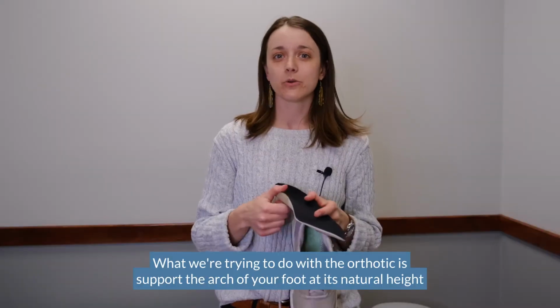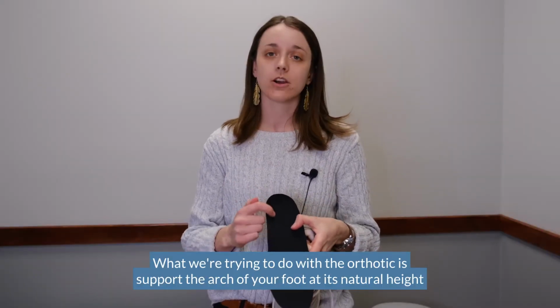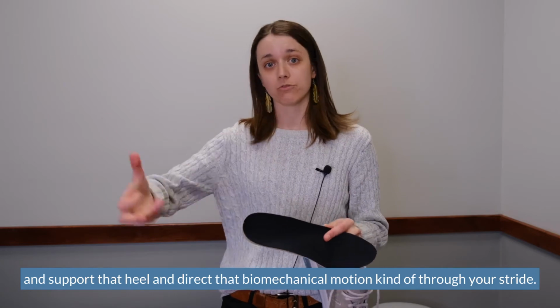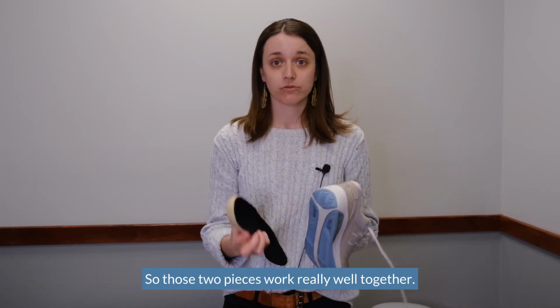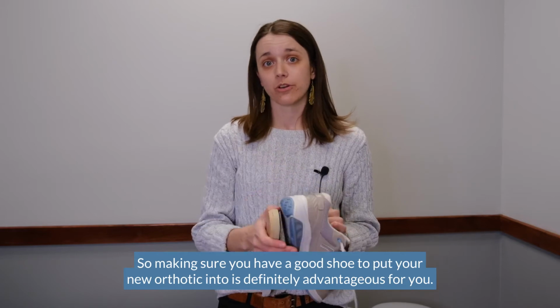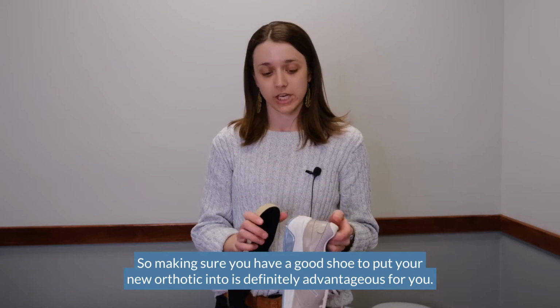What we're trying to do with the orthotic is support the arch of your foot at its natural height and support that heel and direct that biomechanical motion through your stride. So those two pieces work really well together, so making sure you have a good shoe to put your new orthotic into is definitely advantageous for you.